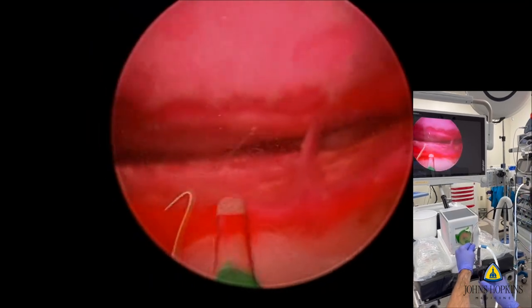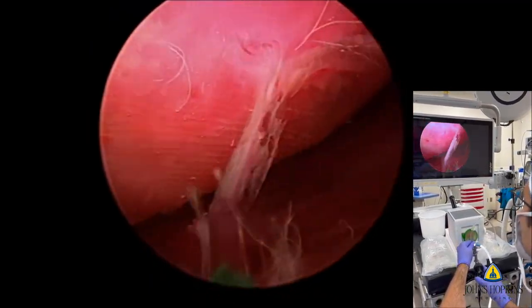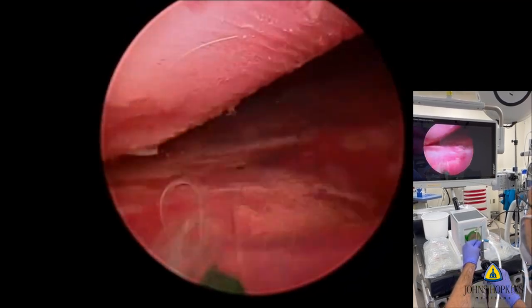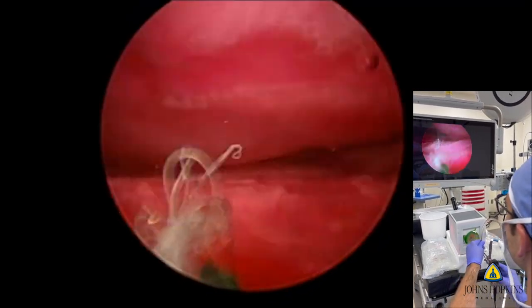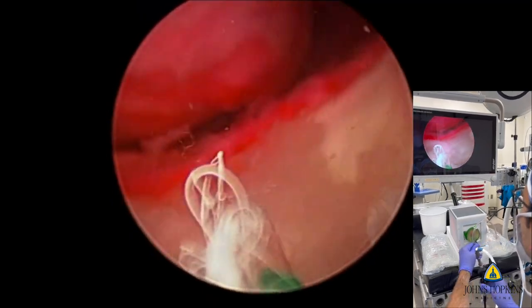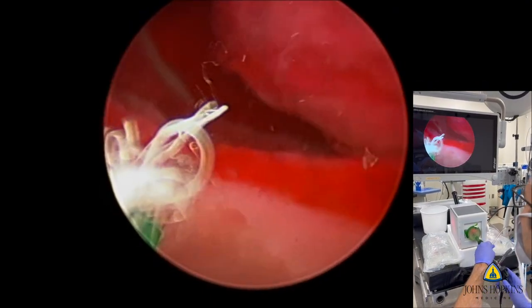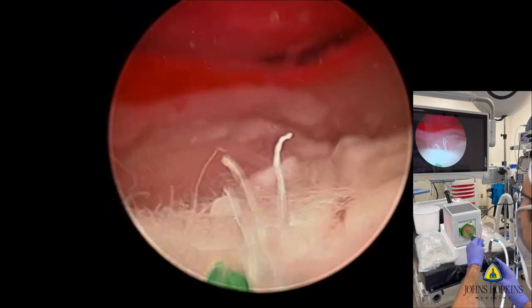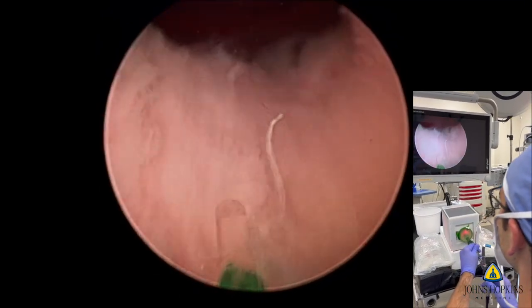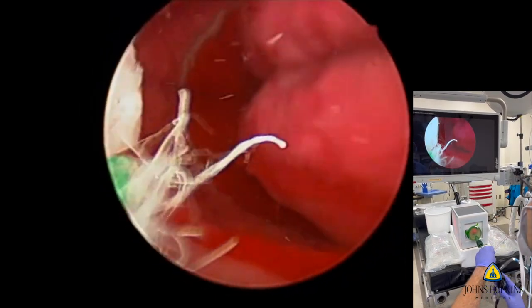Then you can check the fossa to make sure that there are no areas of bleeding, and that you haven't injured the ureteric orifice, the external sphincter, or any critical components. We've actually created a grading system similar to the GEARS and OSATS systems that enables us to evaluate your performance. But more importantly, you can take that adenoma and weigh it — because you know the adenoma was 85 grams — and look at the difference to see how much of the adenoma you left behind.